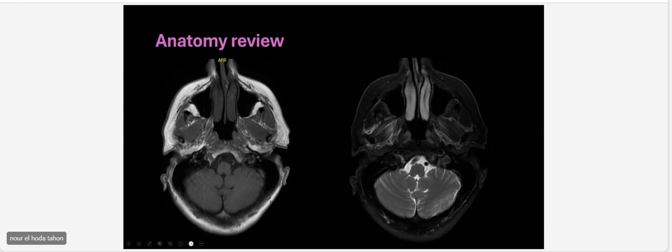So this is fat, not suppressed. Yes, exactly. Who said that? It's darker, in the dark. Yeah, exactly. Very dark. So this technique, we suppress the fat. We mean to suppress the fat. So any lesion or any bright signal, this means it's not fat. If it's in the place for fluid, okay, it's a fluid.